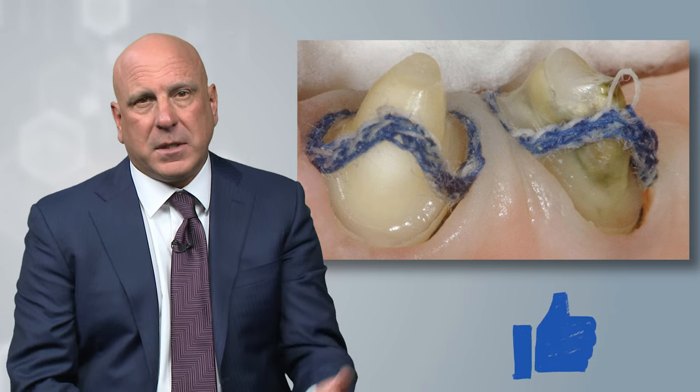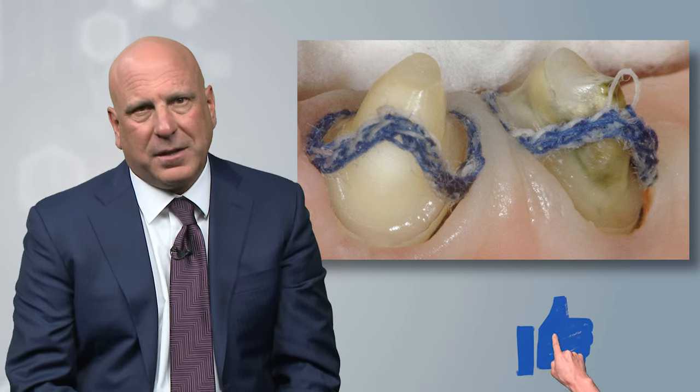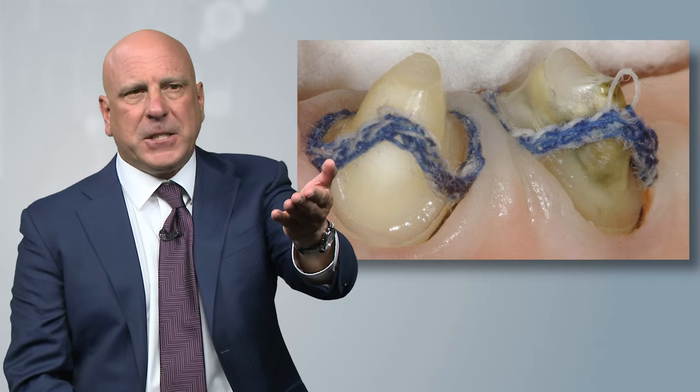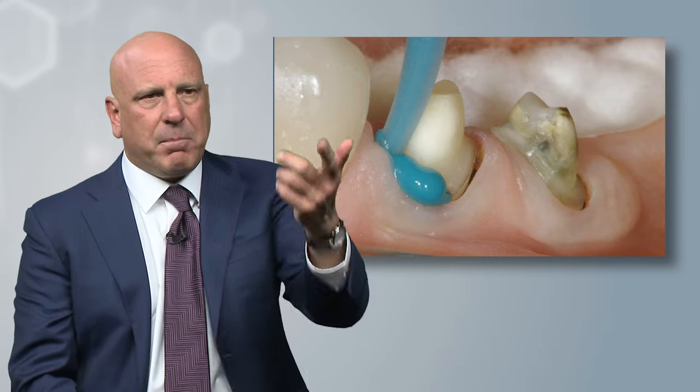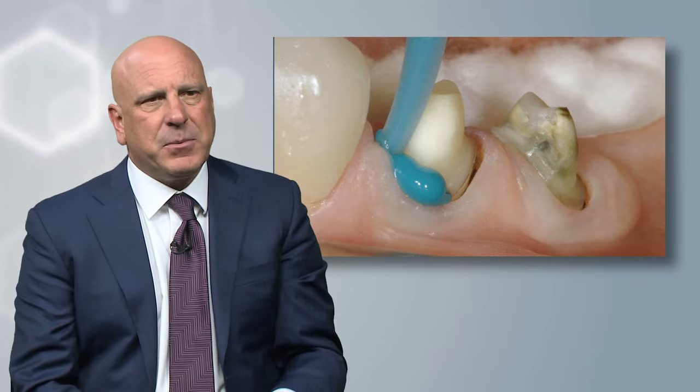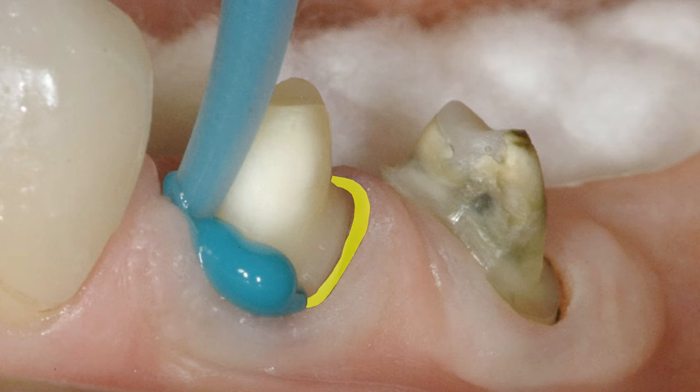Is it more time? Yes, two cords takes more time than no cords, as you might expect. But is it worth it? It's incredible — you can't miss that impression. You're going to be taking a polyvinyl gun and squirting it in just like this. Look at all that space we have here. You can see a wide space between the sulcus and the tooth structure itself, and we're looking deeply into the sulcus and seeing what we can see.